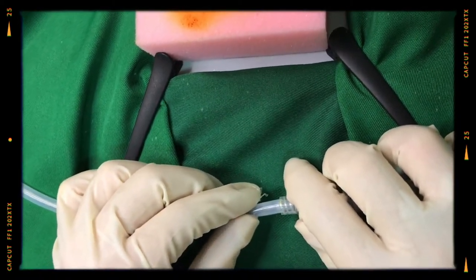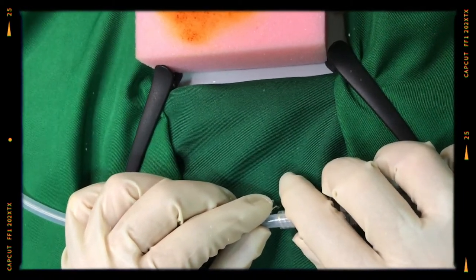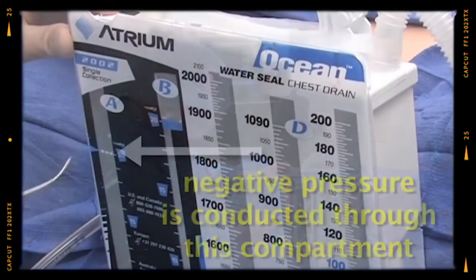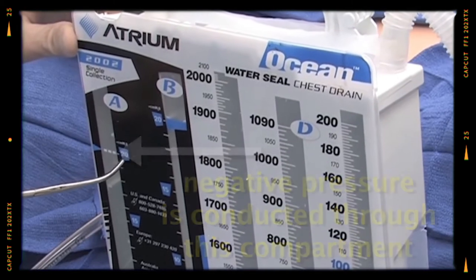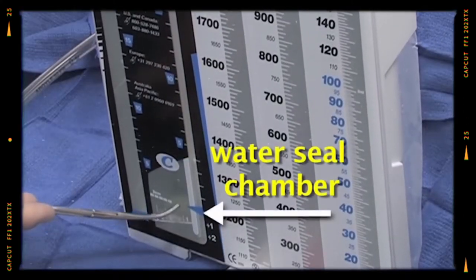Connect the tube to the underwater seal chest drainage system and remove the distal kelly clamp. Care should be taken to do this step properly as this may cause pneumothorax if the tube is disconnected from the underwater seal.